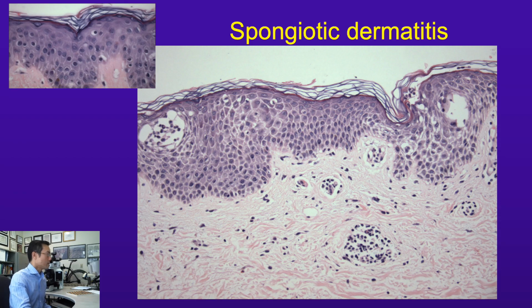With sufficient spongiosis, spongiotic vesicles form, small collections of intercellular fluid associated with various inflammatory cells, such as lymphocytes, sometimes eosinophils or neutrophils, as well as resident intraepidermal Langerhans cells.